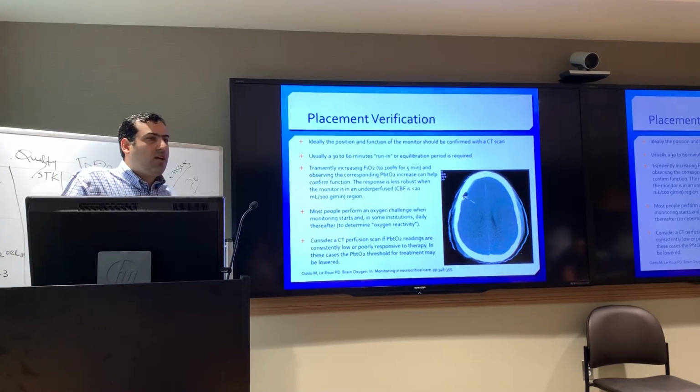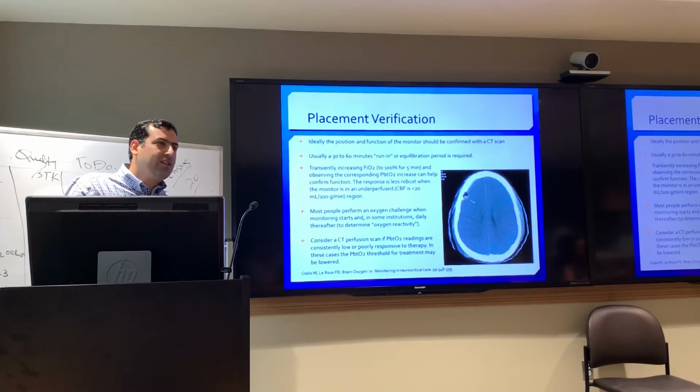That's experimental. It develops over weeks. So I think the data we have is at least for 2 weeks. People have been using it without issues. We have not used it longer than that. But I haven't heard from anyone a concern of gliosis making it inaccurate over time.